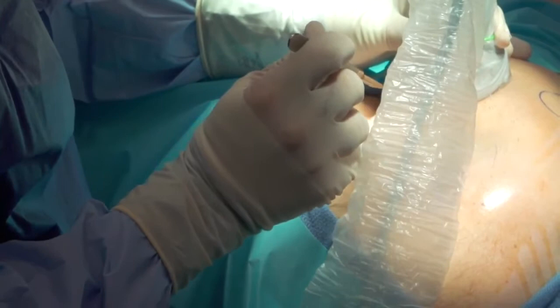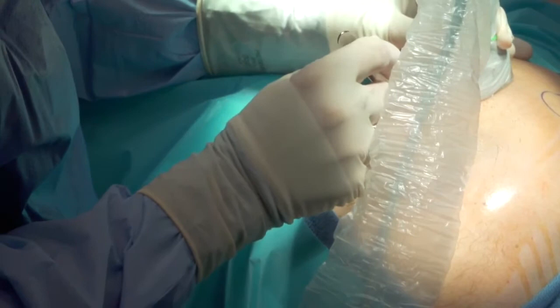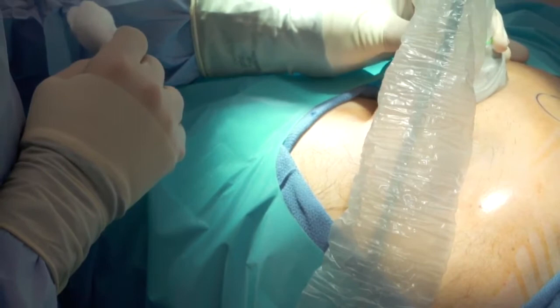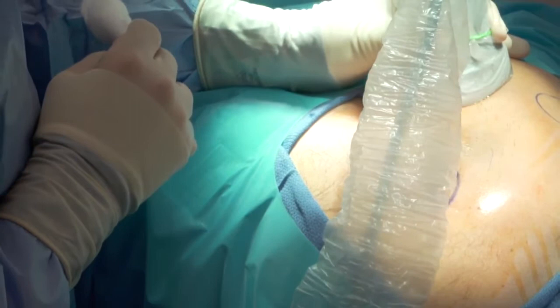Again, one of the things that you really got to be careful of when doing this procedure is to ensure that you don't move the ultrasound too much during the procedure. Here you go, Michael. Thanks, buddy. Because if you move the ultrasound too much, that nice view that you had changes. And then all of a sudden, you're now not knowing exactly where you're aiming, which is, again, kind of what I just did there. So I'm going to try to relocalize that position.